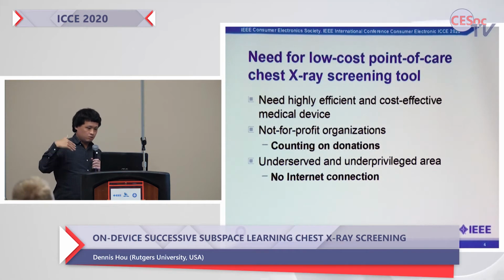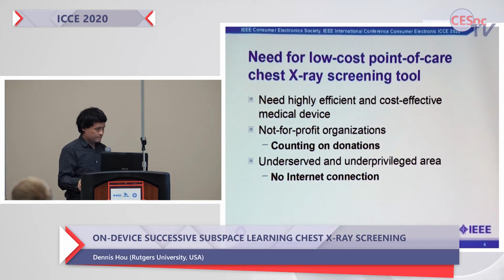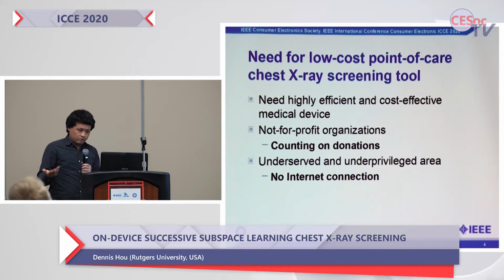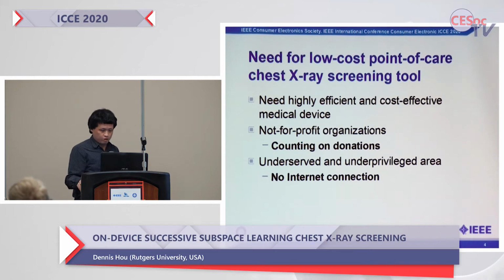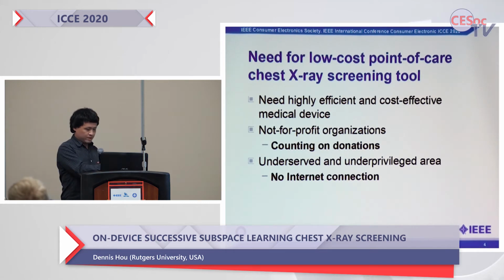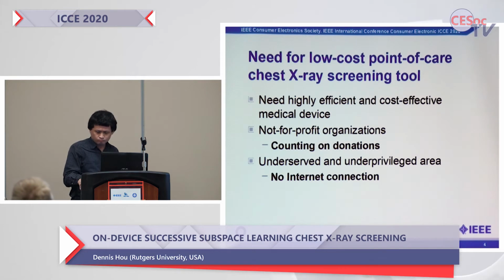Okay, so, the need for a low-cost screening tool, and this would just be the first stage. After this, you have to move on to other things to try to rule out other potential differential diagnoses. But essentially, you have a lot of situations with nonprofit organizations. Nearby, there's a homeless shelter in Nevada that has this kind of problem, where they have no funding and they'll take anything.